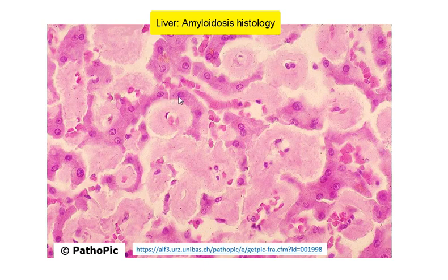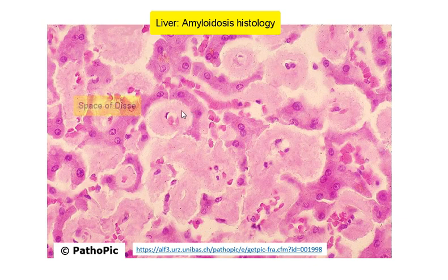These are the residual hepatic cords — you can see this here. The hepatocytes themselves are quite atrophic because they have been compressed by these amorphous, pale, pinkish amyloid deposits. You can see, for example, this hepatocyte, this hepatocyte — they're really encroached upon by the amyloid. And the amyloid deposits are found in the space of Disse, meaning that they are between the hepatocytes and the sinusoids.